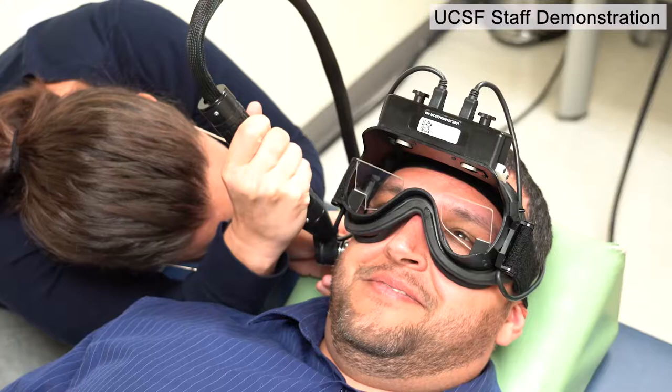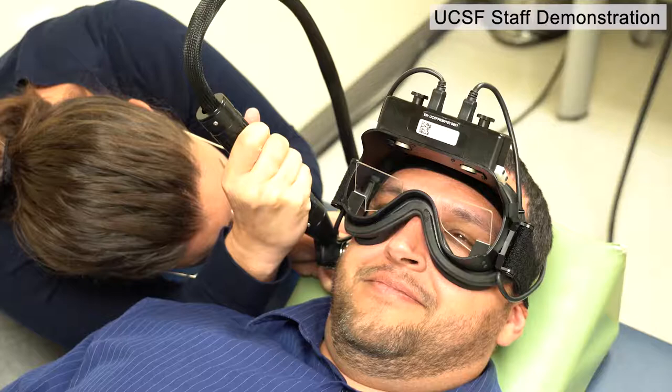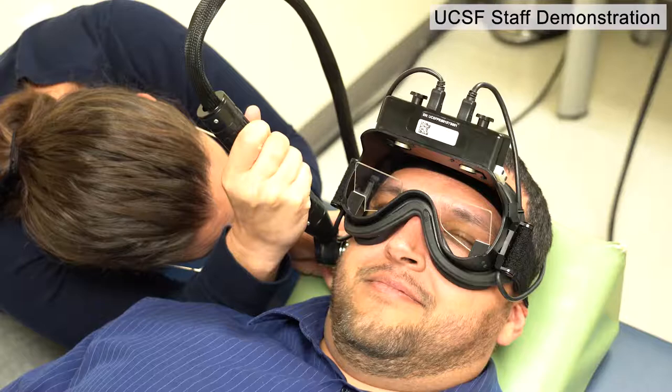Instead of video nystagmography, your doctor might recommend a very similar test called electronystagmography. In this case, eye movements are sensed with a set of electrodes rather than with infrared goggles.